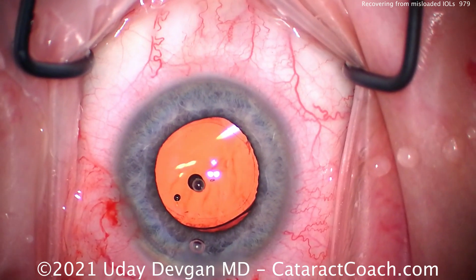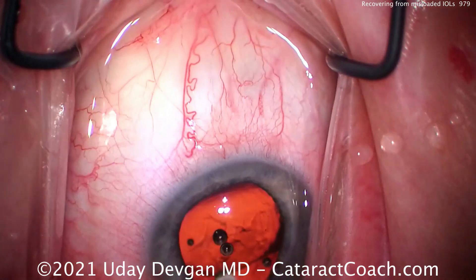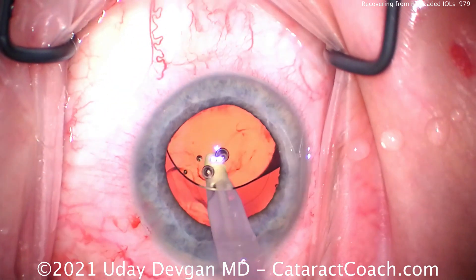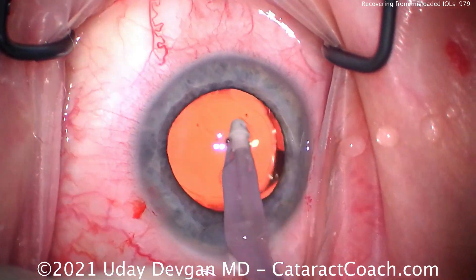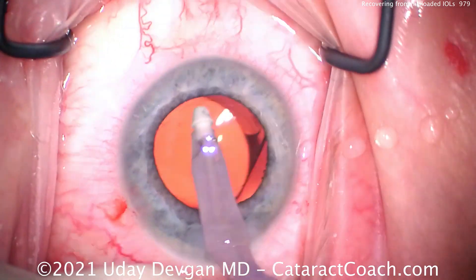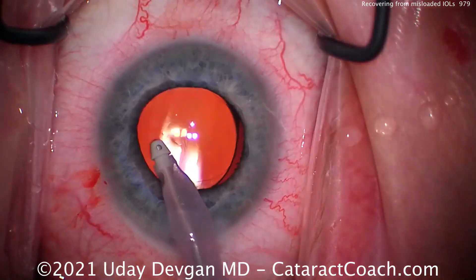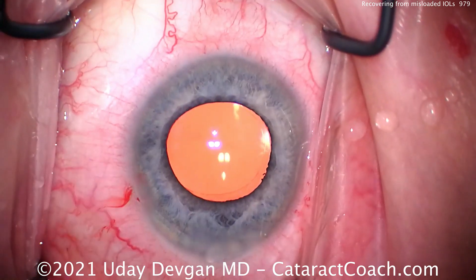You can see this lens looks great — it unfolds completely. Clearly there's no optic damage or fracturing from the injection. It was just that leading haptic that was misoriented. Remember, we've talked about the 7L rule: when the first haptic comes in the eye, it should have the orientation of the number 7, and then the trailing haptic, when it goes in the eye, should have the orientation of a capital letter L. So 7L rule — first haptic comes out like a 7, trailing haptic comes out like a capital L. That's the correct orientation.